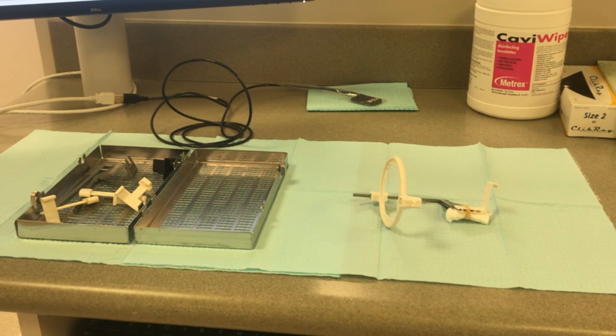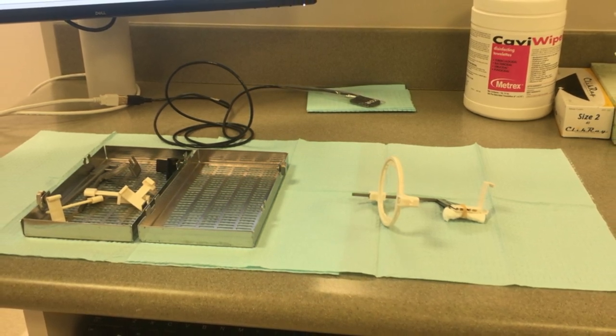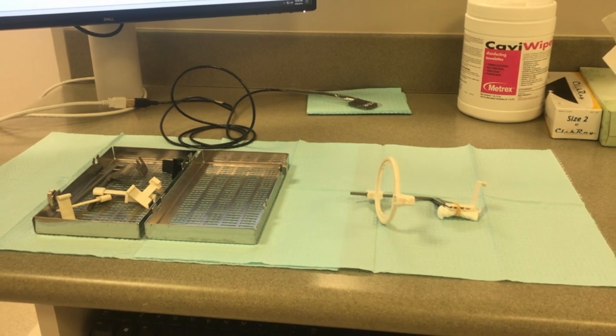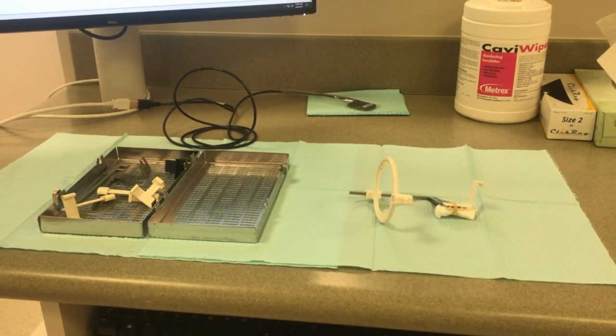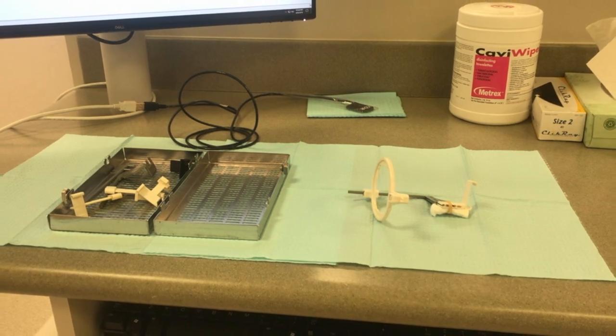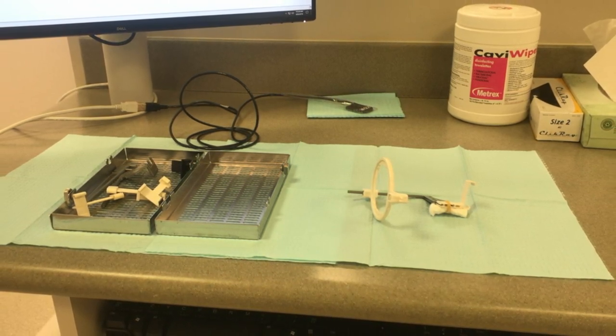Place two napkins down. Set up the posterior bite block. Put the cotton roll and rubber band on the bite block. When assembling the indicator arm, make sure you're using the one that says posterior. When sliding the ring, make sure the indicator arm is going through the slot marked with a letter P.